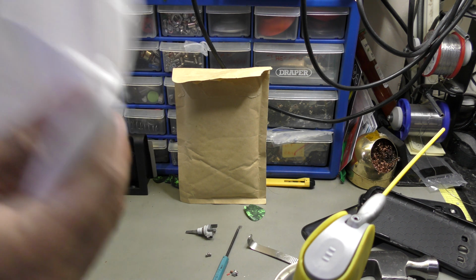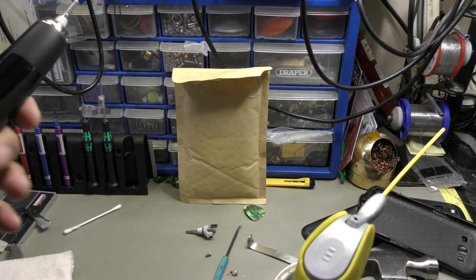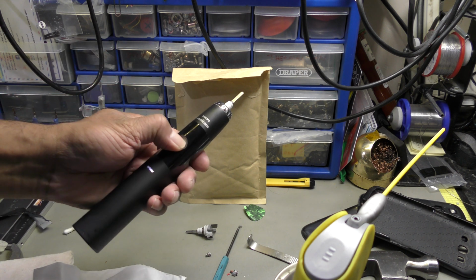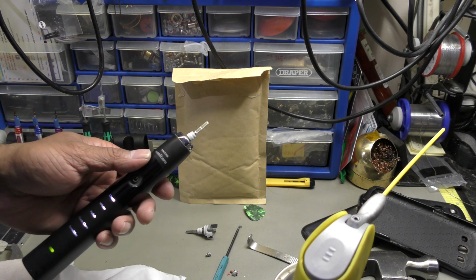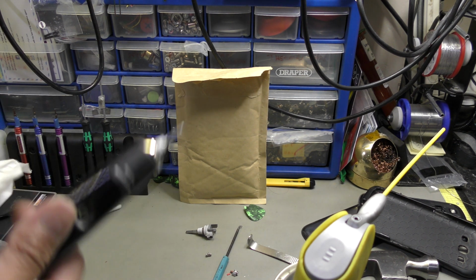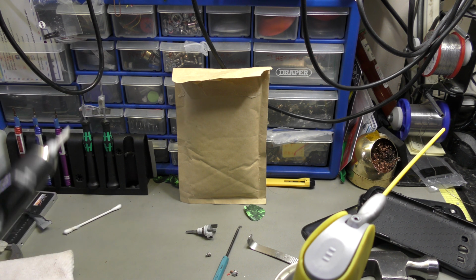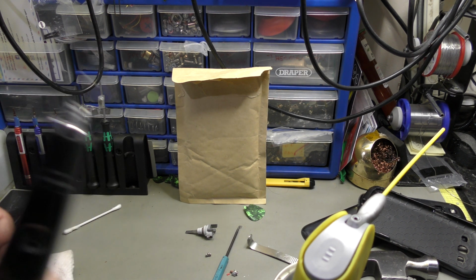I'm going to leave positive feedback for the seller. Absolutely amazing. And look, it's less noisy. Now what I'm going to do is let the Loctite cure for however long it takes. The next time I'm going to brush is in the evening, so that's a good 10 hours or so, and by then hopefully the Loctite will be cured.